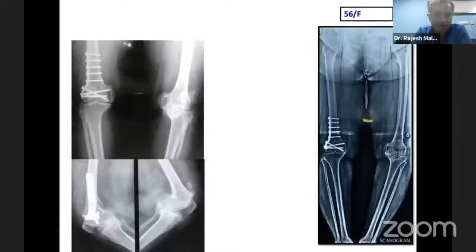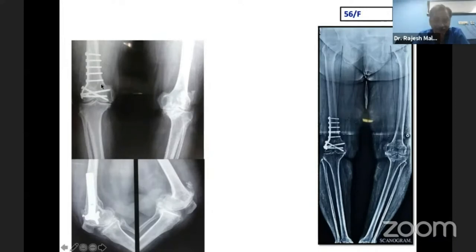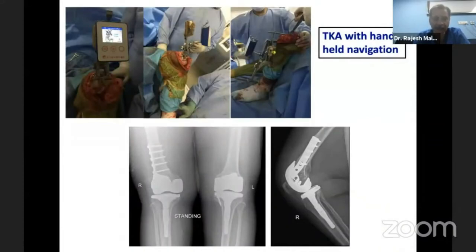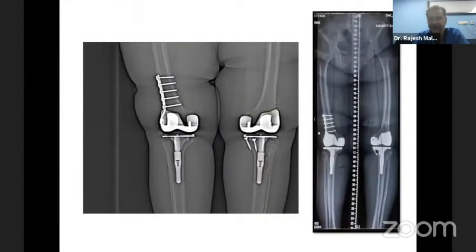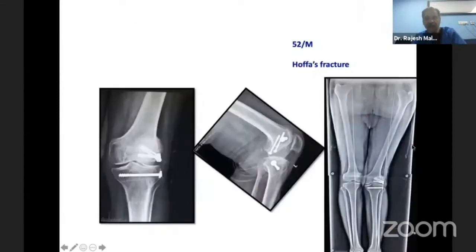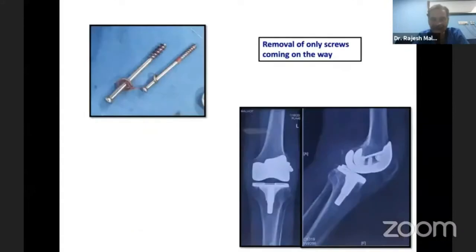Now looking at a few cases on the femoral side: a 56-year-old female who had undergone surgery on the femoral side and developed arthritis. Intraoperative pictures show total knee replacement being done with handheld navigation, deciding not to remove all the plate. Good alignment was achieved, and these are the post-operative X-rays and the standing scanogram of the same patient. In another example, a patient had a Hoffa fracture with implants in situ. Only the implants coming in the way were removed; the screw on the femoral side not obstructing was left in place.